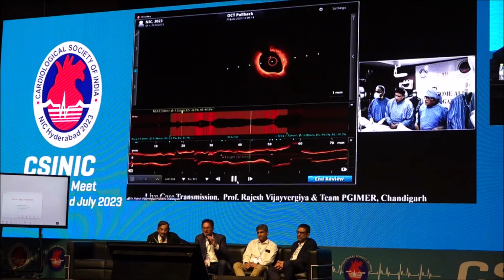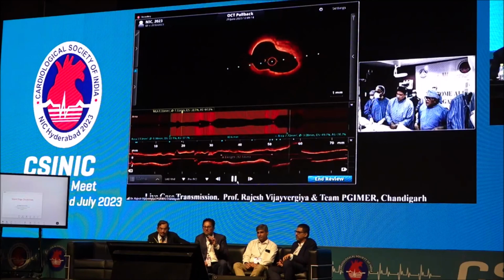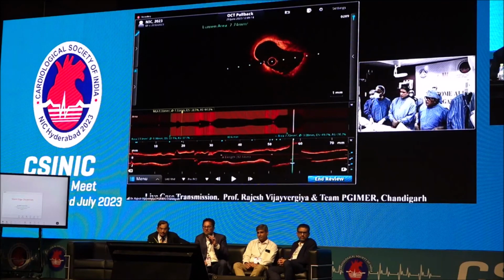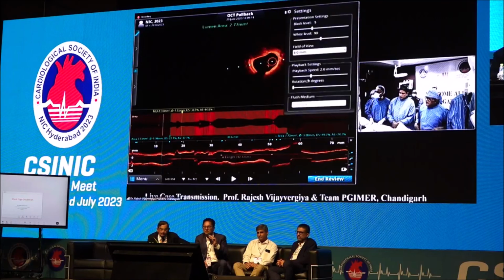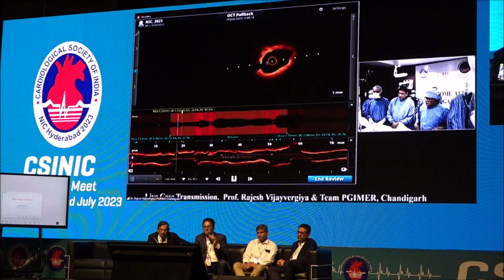Rajesh, in the interest of time, because we have to go to another case also, what is your strategy now? My strategy is to go ahead and put the stent across, say, left main to LAD crossover. Focal LCX lesion can be taken care of by, say, balloon dilatation, and thereafter let me see what the result is across the left circumflex, and then decide whether to put the stent or what next. So you would do just a regular non-compliant balloon into the circumflex, not a DCB or cutting balloon?